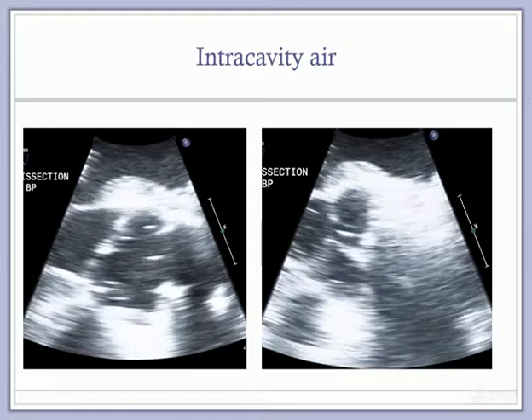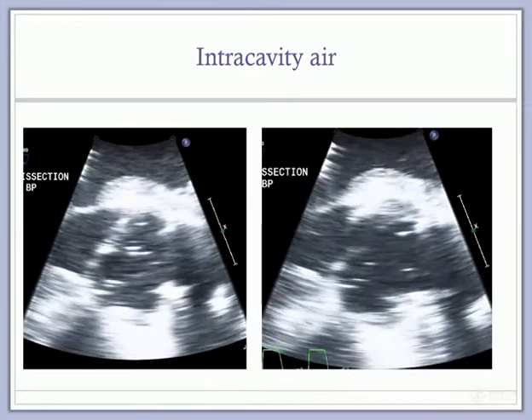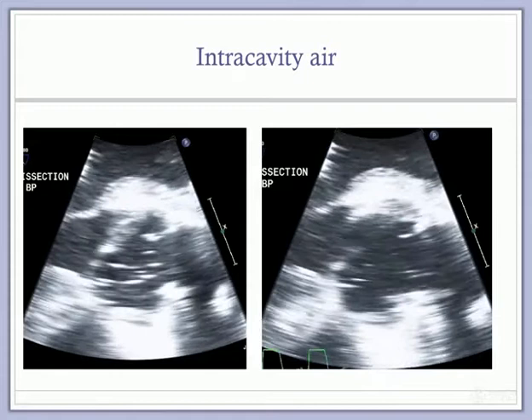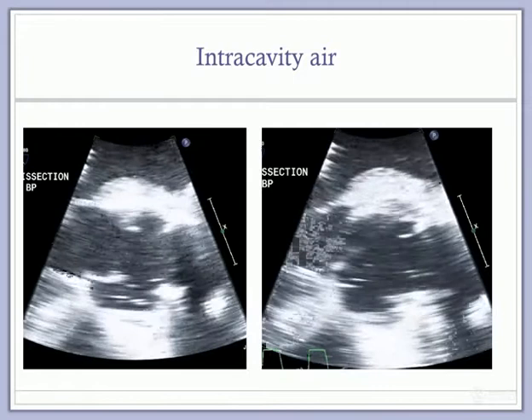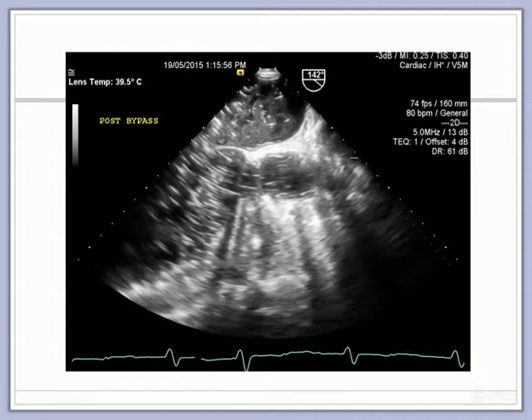So air in the aortic root will tend to go down the right coronary artery as it is the uppermost. The clip on the right shows the surgeon agitating the aorta, trying to dislodge air in the sinuses. Coronary artery air can manifest as ST changes, arrhythmias, and sudden, often right-sided ventricular failure. Resting the heart on bypass and running high pressures to try and flush the air down the coronaries is the mainstay of treatment. Left-sided air can be alarming, but it's usually cleared quickly.